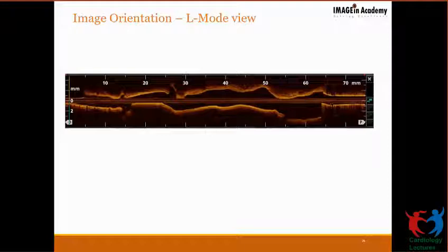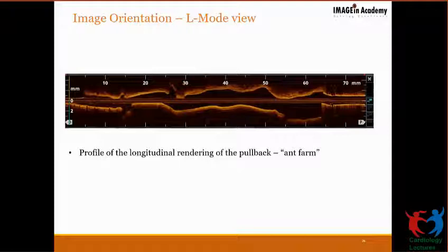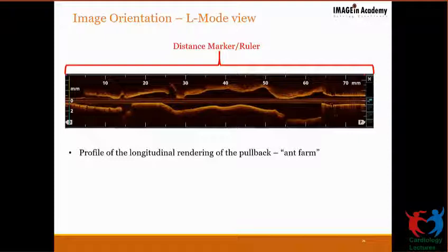But more importantly, this is a kind of stretched view of the vessel, and when you look at this view, you will have some distance markers. I told you this is a view which is essentially used for measuring the lesion length. You have the proximal and distal marker, these two yellow arrows which have emerged on the slide, and at the same time you have a depth indicator. Now this blue thing is the depth, which tells you the depth at which it has been imaged and what the depth of the vessel is like.